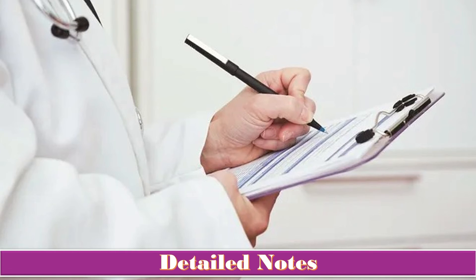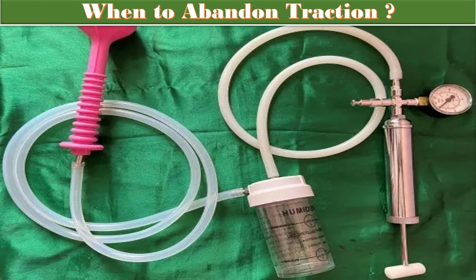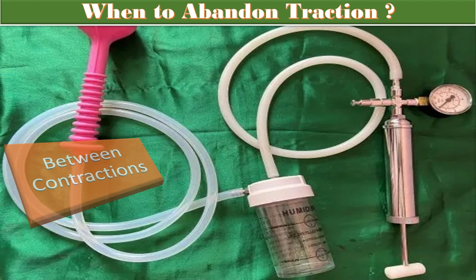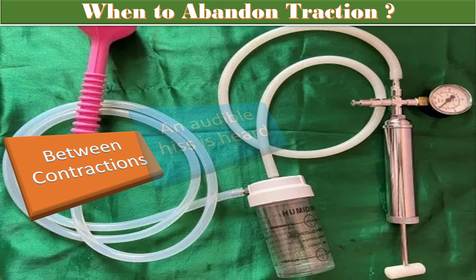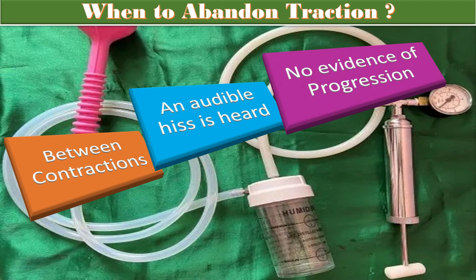It is very important to know when to abandon traction. First, abandon traction between contractions. Second, if an audible hiss is heard, signaling loss of vacuum. Third, when there is no evidence of progression, no descent, and delivery is not imminent following three contractions after correctly applied instrument by an experienced operator — in all these cases, abandon the traction.